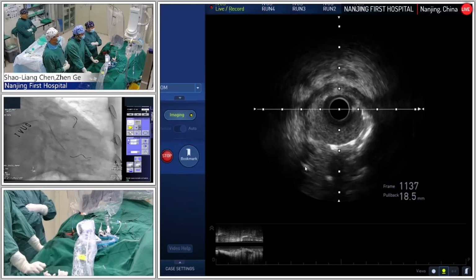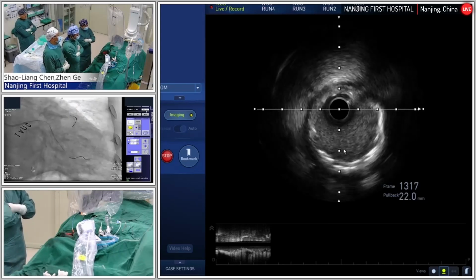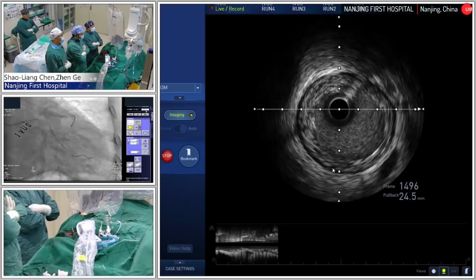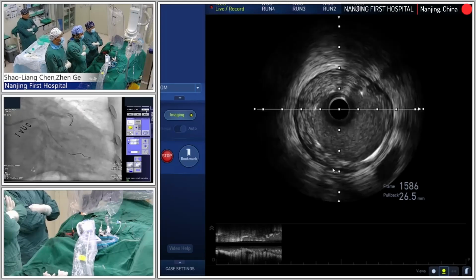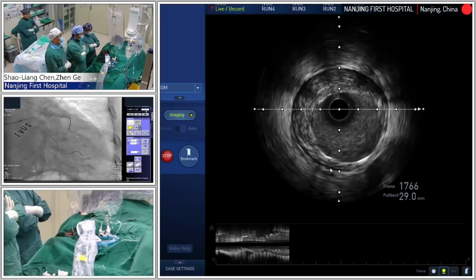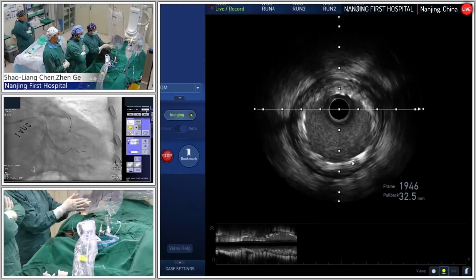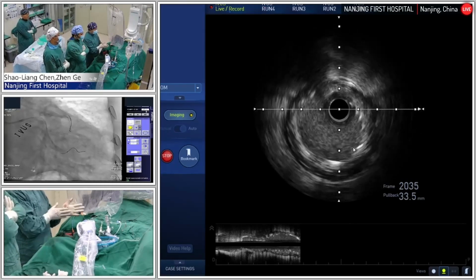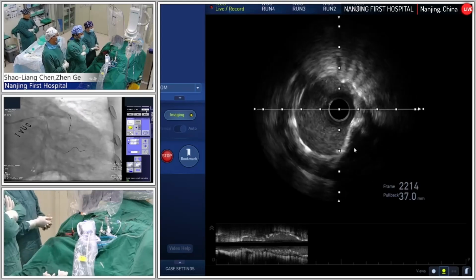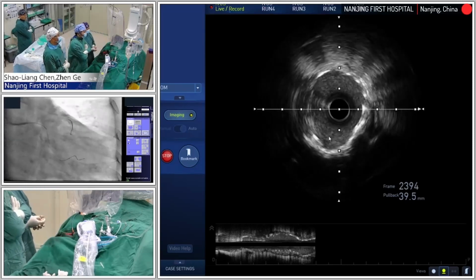The distal segment. This is a bifurcation. Stent carina is in the middle. You can see the proximal segment looks good. It is almost 3.5, because this is the stent. Very close to 4. Use the 4.0 for post dilation. It is 3.5. Good. So this is the 2 layers of stent. Probably double layer.